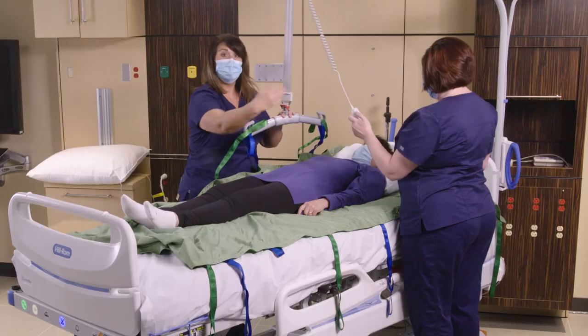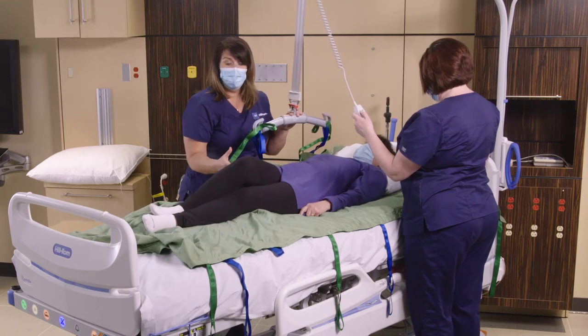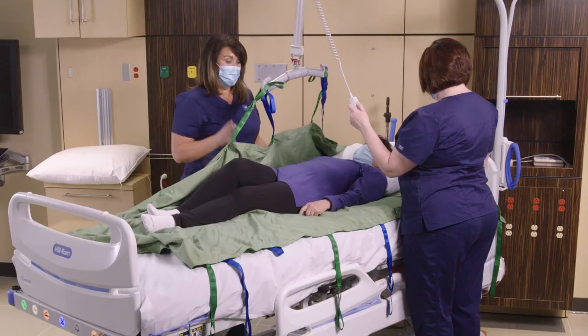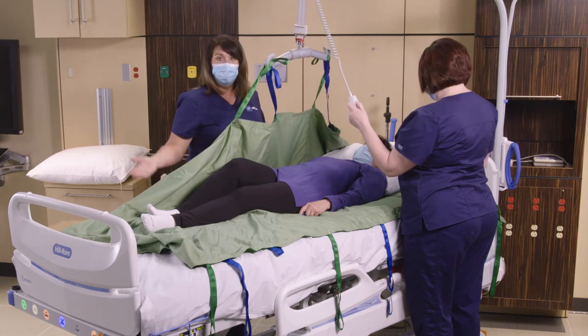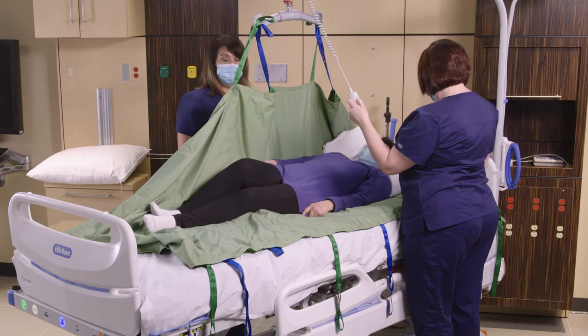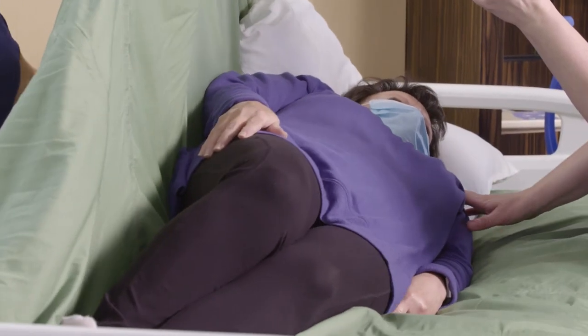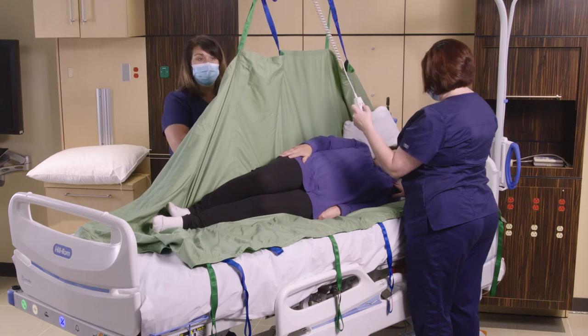I'm going to give the controls to my partner because she can see what kind of turn is going to happen. If our patient can help, we're going to bend the knee. We're always communicating with our patient, making sure that they're safe and comfortable, and then this will get them a nice turn. When we get them in the turn position, we can put in our wedges and pillows to keep them in that position.